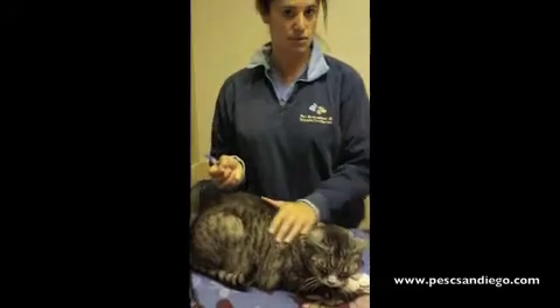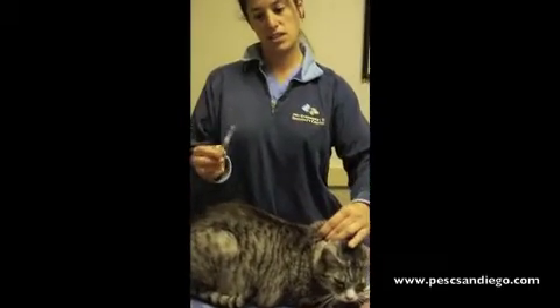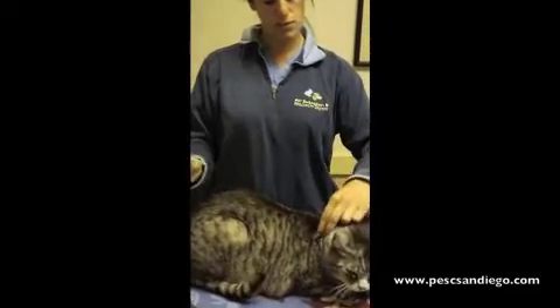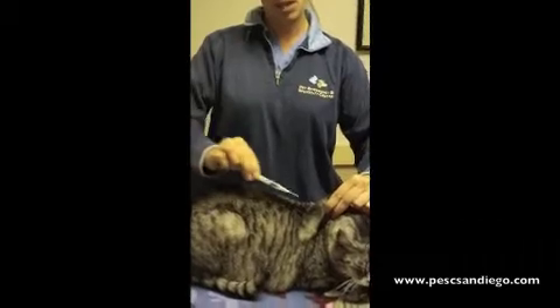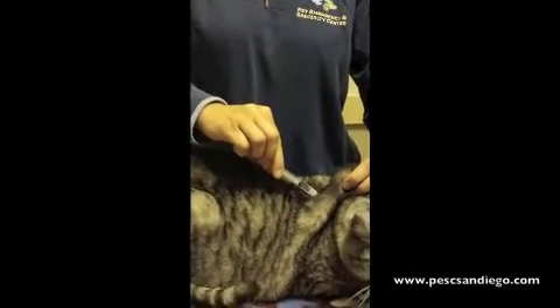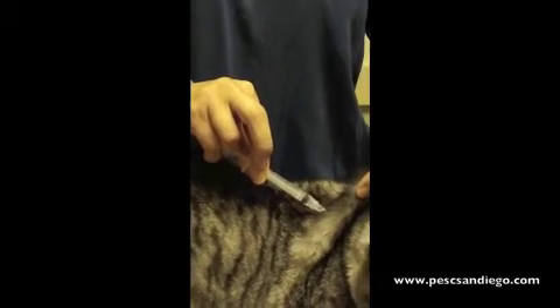Again, exactly like the sub-q fluids, we're going to tent up the skin on the back of the neck. The only difference is we are going to aspirate to assure that we have not hit a vessel. So, tent up your skin, puncture your needle in through the skin, pull back on your needle assuring there is no blood in this hub, and then administer your injection.